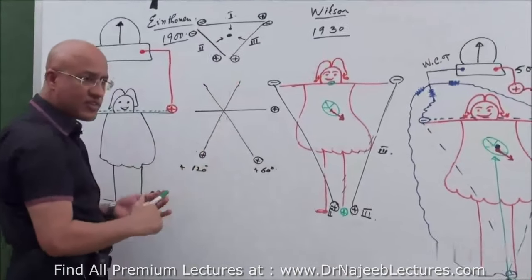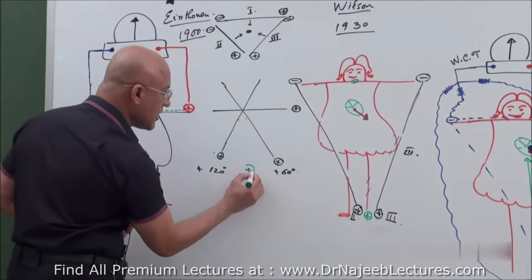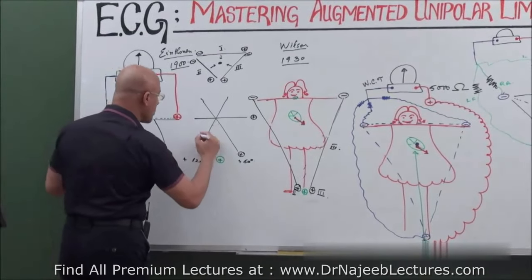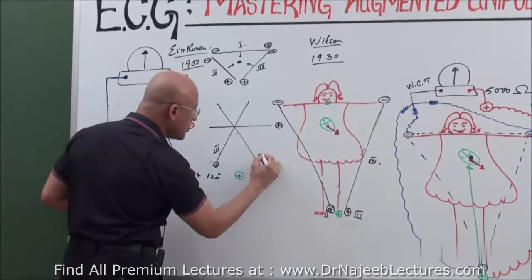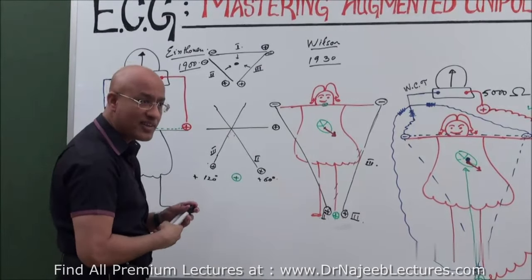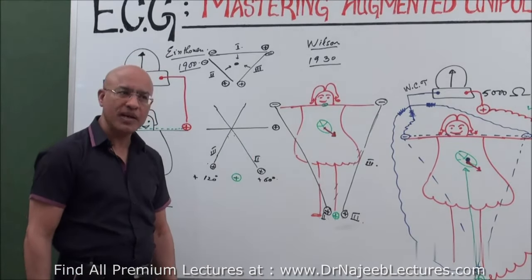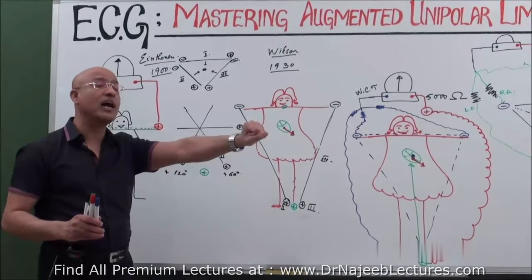This was the bipolar lead system. He achieved a lead which is looking, positioned between lead 2 and 3. This was lead number 3, which was looking upward and leftward. This is lead number 2, which was looking upward and rightward. Both of them were probably missing the real point. So Mr. Wilson came. These leads were developed by Einthoven. Then Mr. Wilson came. He made unipolar leads. How did he make the unipolar leads? He kept the positive electrode the same. Now which is called?